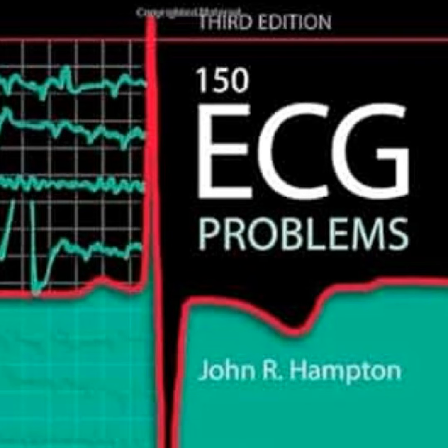And tracing this back to the 80-year-old patient's symptoms, this electrical detour is, like we said, highly inefficient. Very. The atrial fibrillation means he has totally lost his atrial kick, and the LBBB means his ventricles are contracting asynchronously. Right, so his overall cardiac output just drops. Which directly leads to the dyspnea and the peripheral edema. Yes. Like the tracing is literally showing us the mechanical failure of his aging heart.